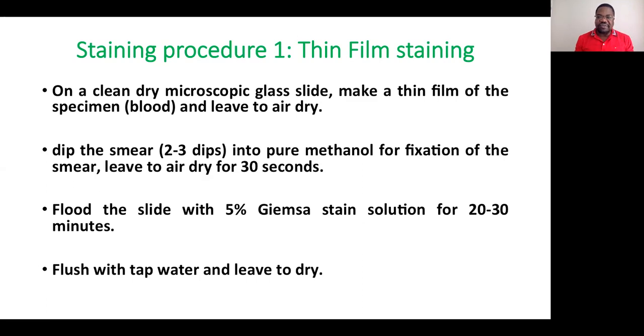So this is one of the differences, because we don't use methanol to fix the thick smear, but we use methanol to fix the thin smear.